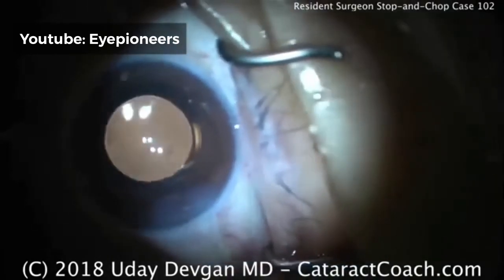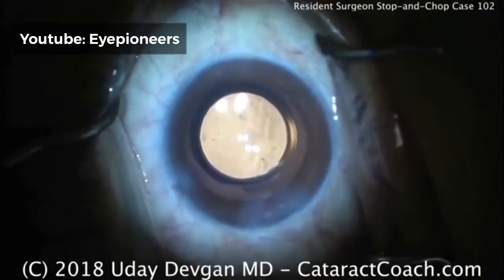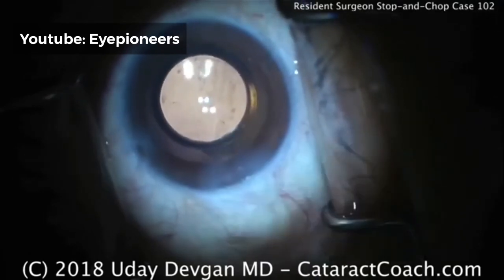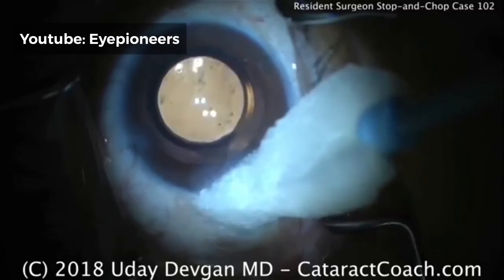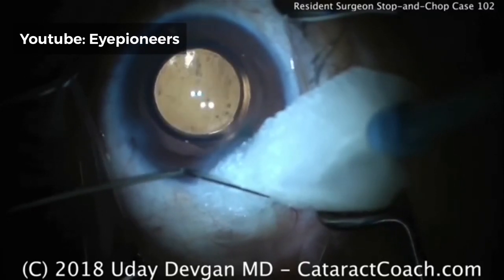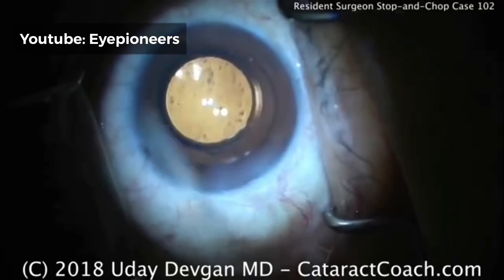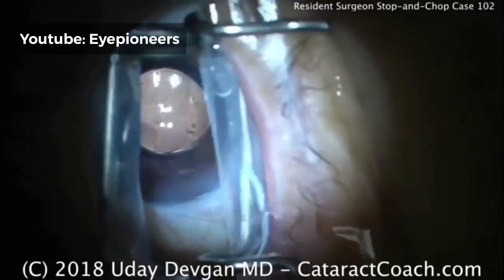In summary, this resident did a very good job with the surgery using a stop and chop technique. Areas for improvement: consider using a dispersive viscoelastic to better protect the corneal endothelium; in creating the capsulorhexis — done very well — maybe fewer grabs and a little longer travel before re-grabbing. During nucleus removal, the grooves were very good — start the groove a little more in the sub-incisional space for a longer groove length. The resident figured out to grab the corner of the nuclear piece rather than the middle. Irrigation aspiration was great, and cortex removal was done very well. Good job for this resident — I look forward to operating with you.